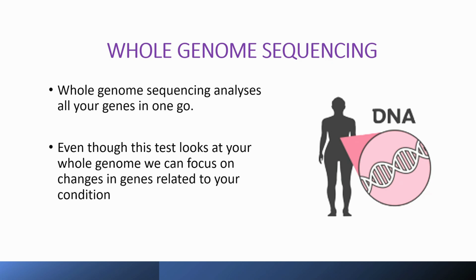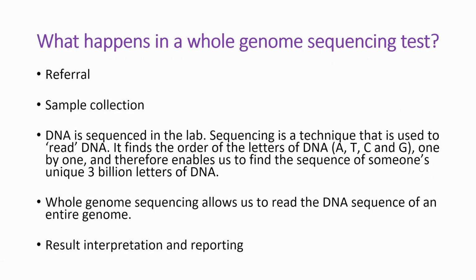So the first offer of whole genome sequencing to patients in the NHS was through the 100,000 Genomes Project, which was a large research study, and it's now carried out as a diagnostic test. I'll just go through the process of whole genome sequencing.